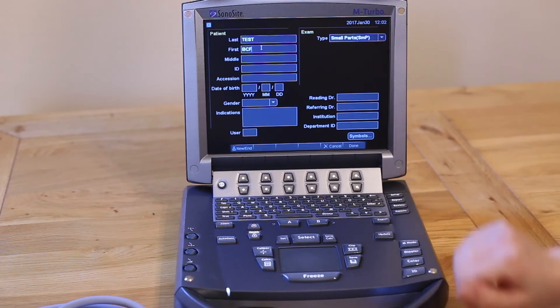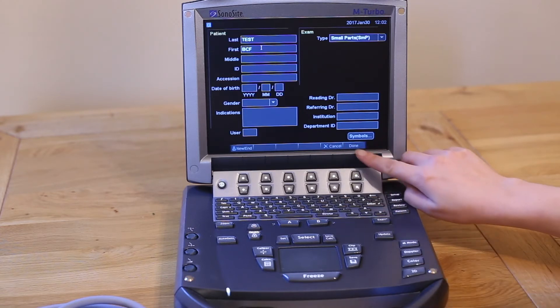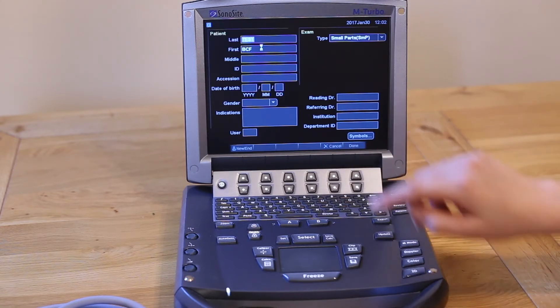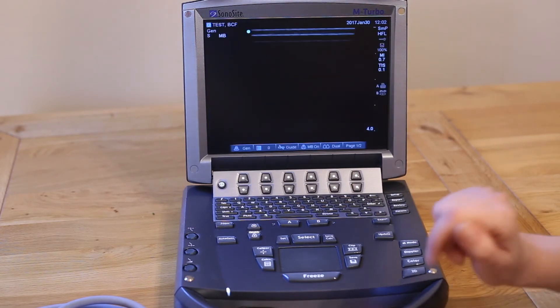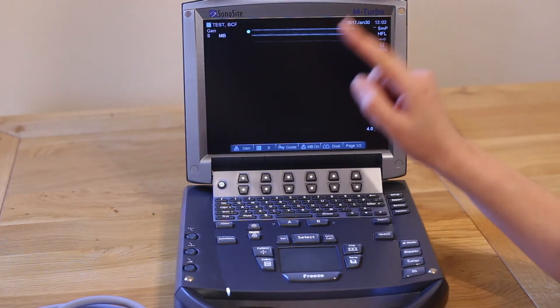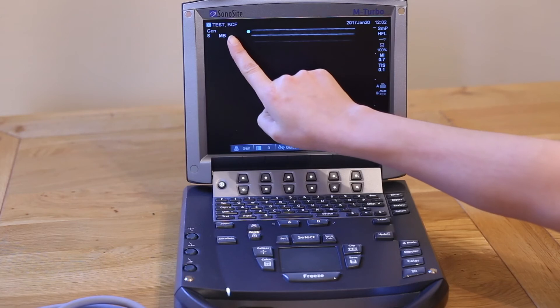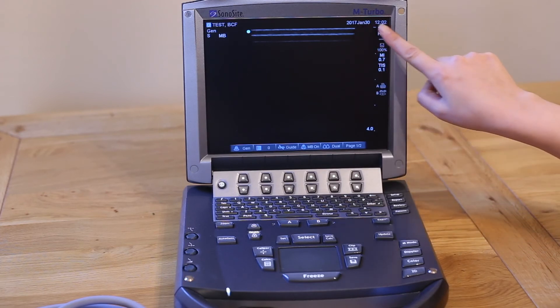More of this in a second. Press the rightmost soft key to select done. You can see your patient details at the top left of the screen to check that you're scanning the correct patient. Also remember to check that the date and time are correct.